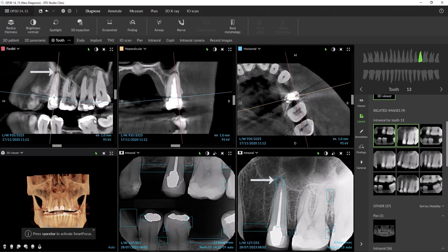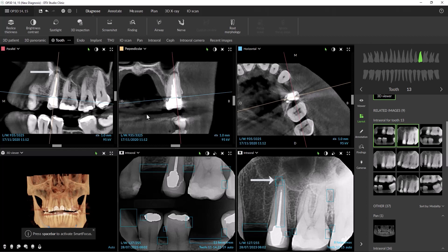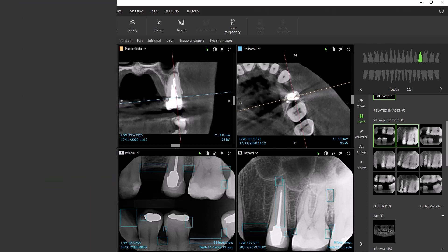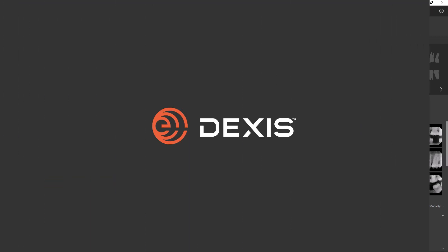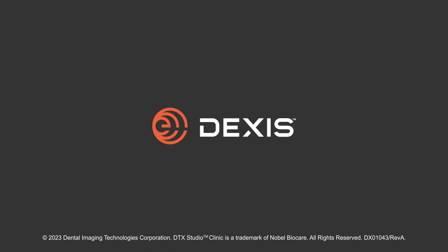Finally, we'll select tooth 13. As we scroll through the sagittal, we can also clearly see the lesion on 13. MagicSort and 2D Dental Findings — two AI features within DTX Studio Clinic — closely work together to save you time and help you focus on your patient.